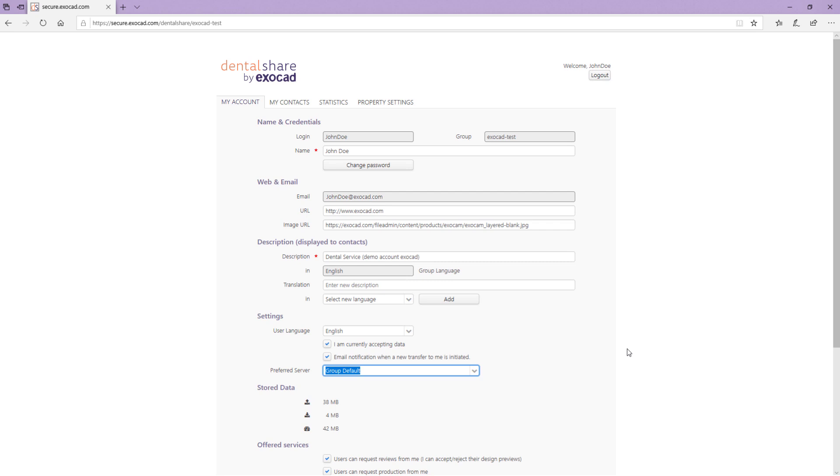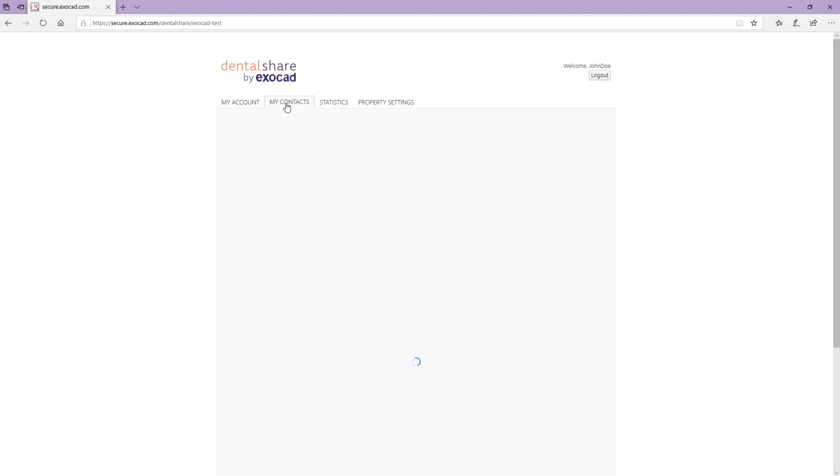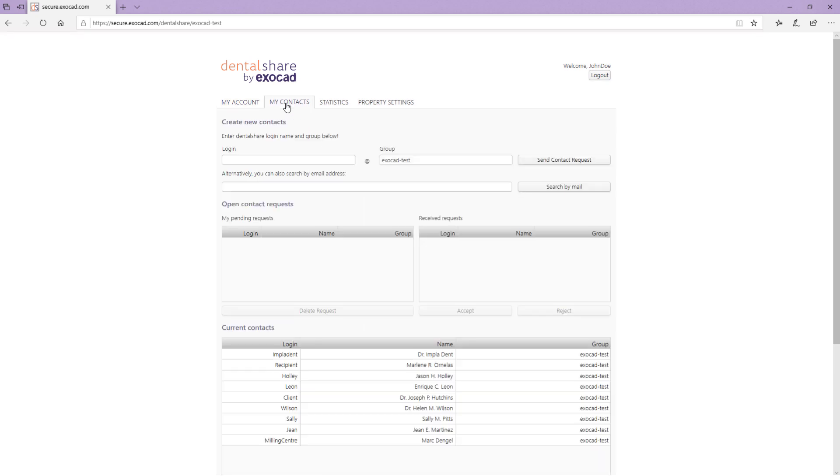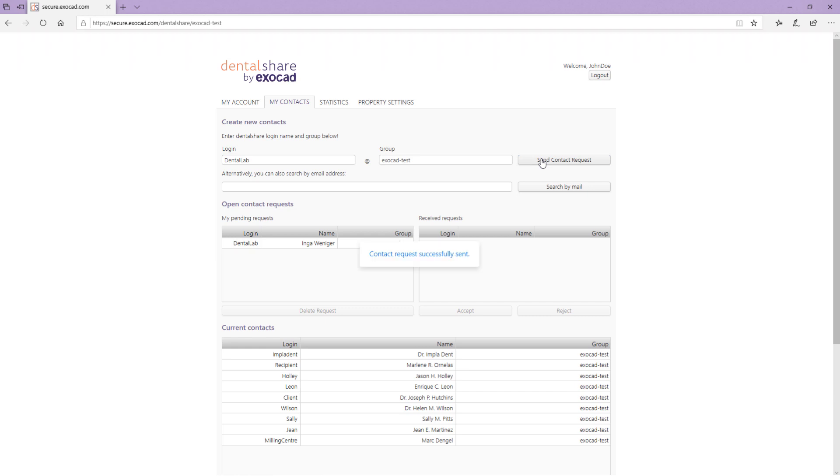My Contacts tab shows all your contacts. To add a contact to your contacts list, type in the desired contacts name in the login field. Click Send Contact Request to send a contact request to the user. You can also search a user by email address by typing the address in the corresponding field and then clicking Search by Mail.